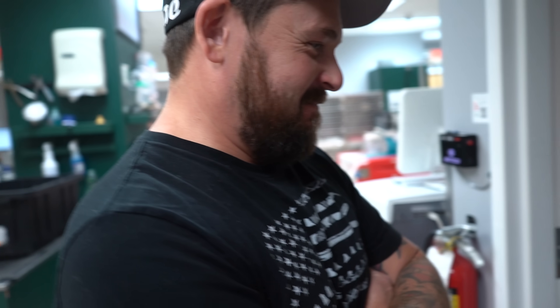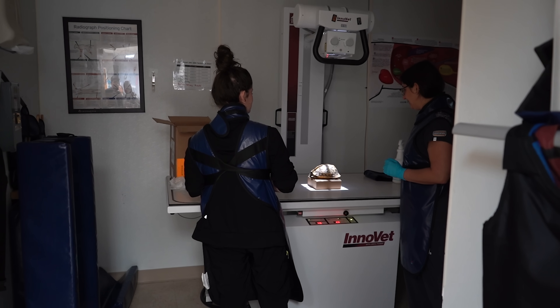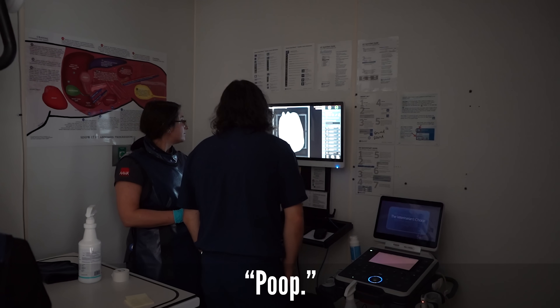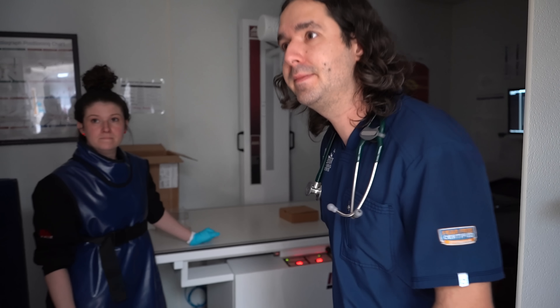Is she gravid with eggs, or is she just really well fed? No. The craziest reveal party I've ever been a part of. Yeah, this is a really crazy reveal party. What is that on the x-ray? There's something in there. You can see something on this one — I don't think those are eggs. Let's take a look. Poop! A little bit of mineralization in there, but I think that could just be some fecal material moving through. It doesn't look like a bladder stone or anything like that. So we x-rayed for poop. Cool.